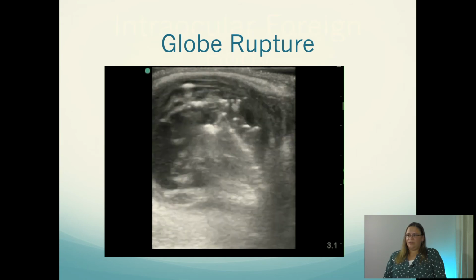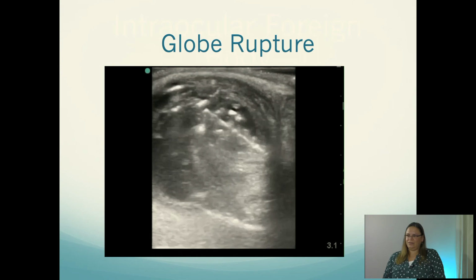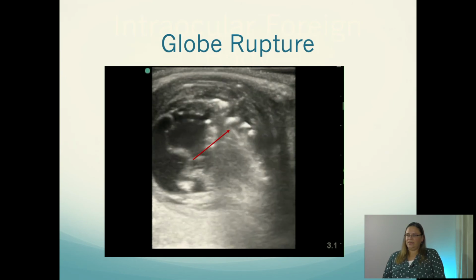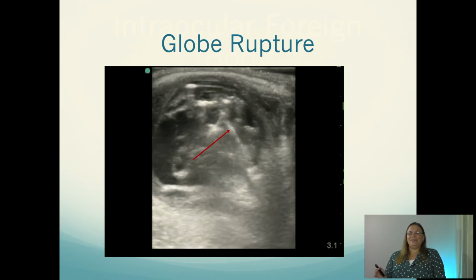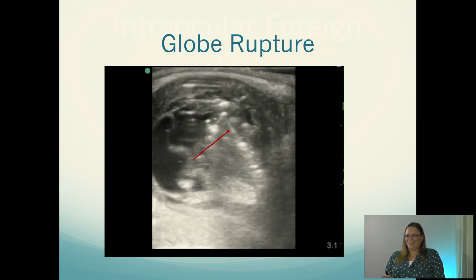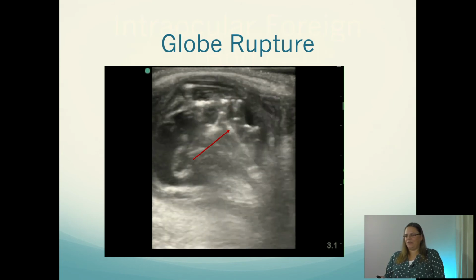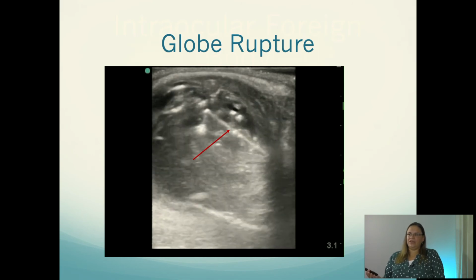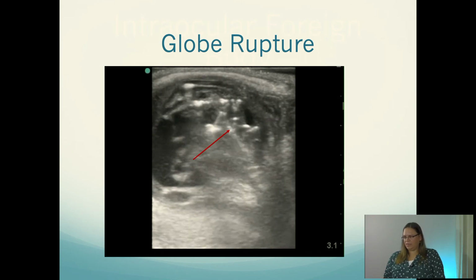Here's another example. In this example, this was a patient who ended up with a needle in his eye. That hyperechoic linear structure there is a needle. It's a little unclear how the needle got there. But again, you can see you get loss of that perfect circular appearance, and you're seeing other hyperechoic material within the eye, and that's all air that's been introduced because of the needle.